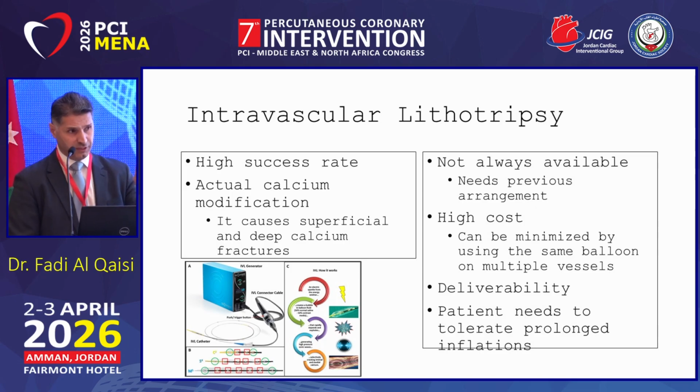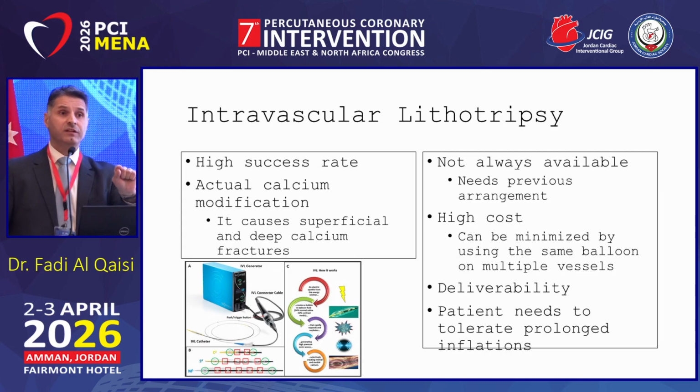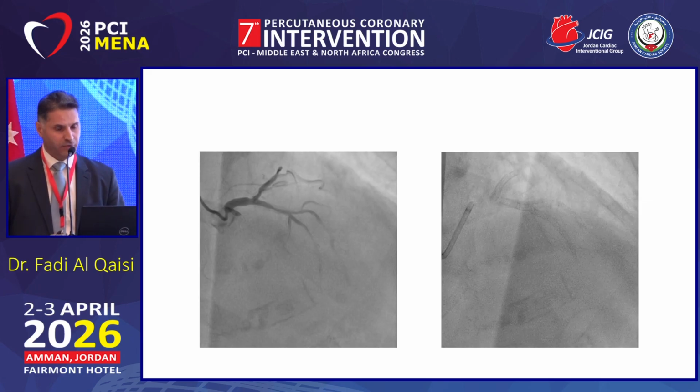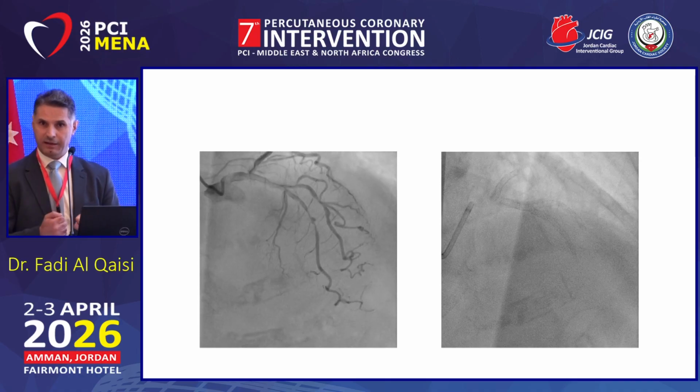It is difficult to deliver. You have to make sure that you are able to deliver this bulky balloon. And the patient, this is important, needs to tolerate the 1 minute inflation and cutting of the flow. So if you are working on the last remaining arteries, it's risky. We have had hypotension and ischemia during inflation of the balloon.